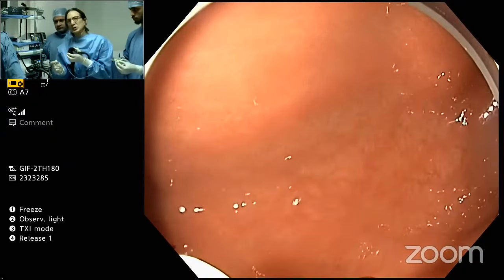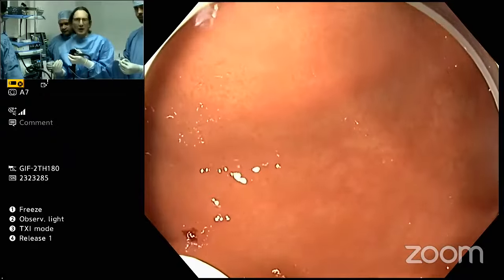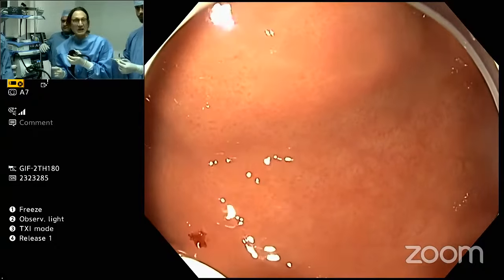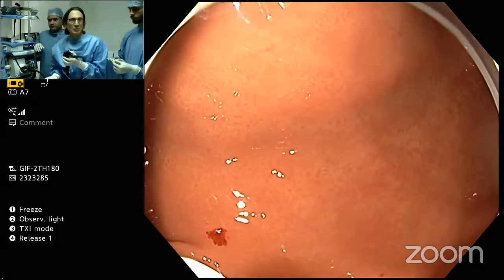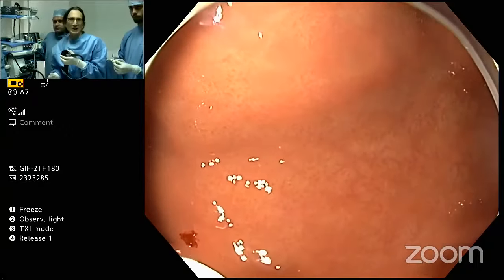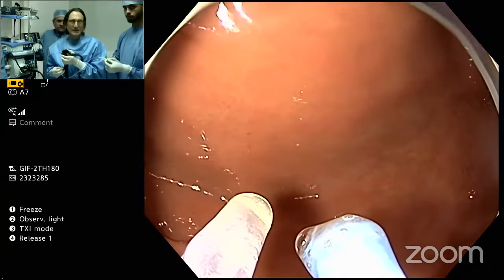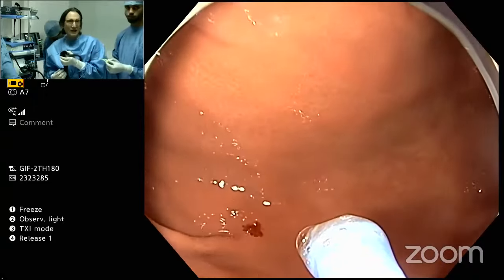What you need to understand is that we have a toolbox. We have different ways of doing things. There's no correct way. It needs to be customized for each patient. Sometimes you don't have a double channel, so you need to do the procedure with a single channel. So you need to have different ways of doing it. A double channel is really great because this is an anchor, it's a helix, and it allows me to anchor. And one of the things I think we are lacking are anchors.